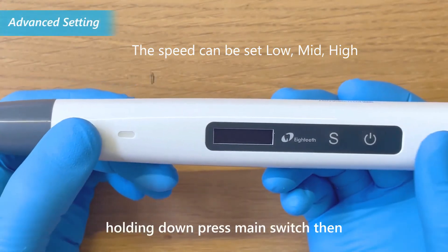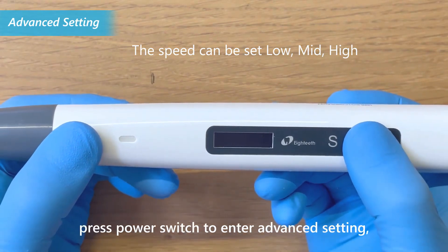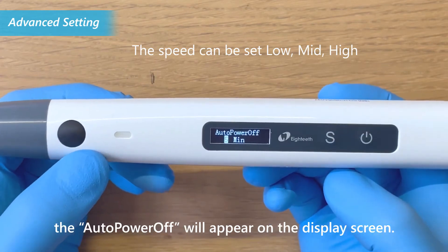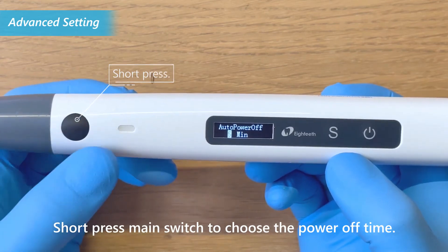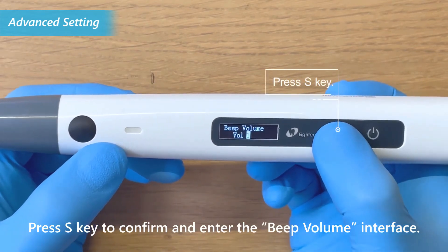During power off state, press the power switch to enter advanced settings. The auto power off option will appear on the display screen. Short press the main switch to choose the power off time. Press the S key to confirm and enter the beep volume interface.